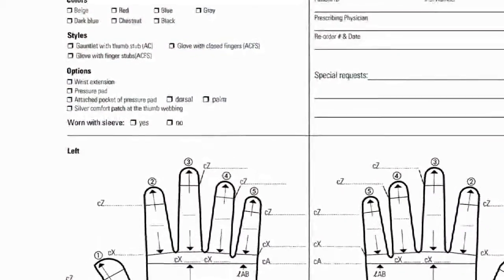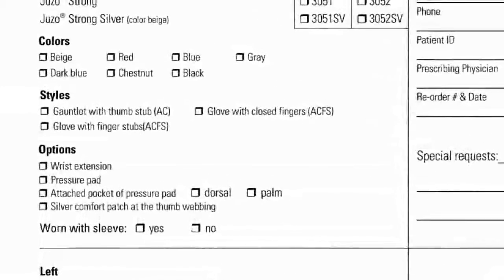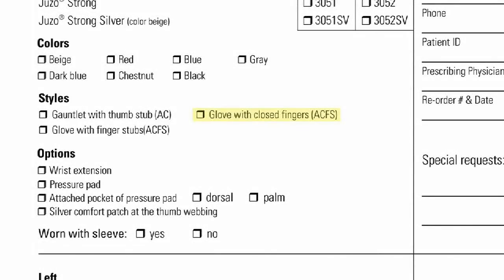Finally, make sure you check the appropriate boxes on your Juzo custom glove or gauntlet form, such as whether a closed finger glove is needed or whether or not the glove will be worn with an arm sleeve. As you can see, it's quick and easy to take a patient's measurements.